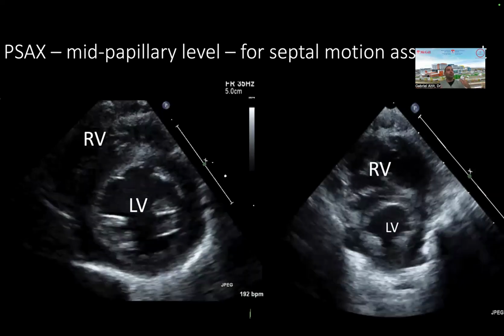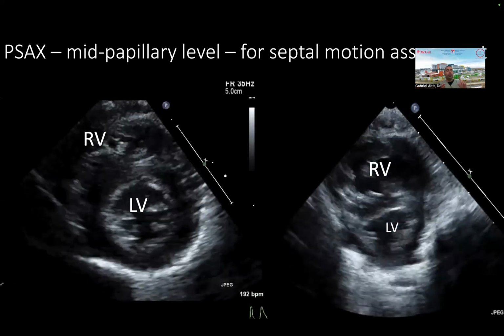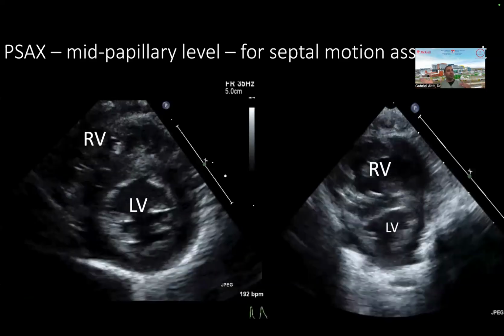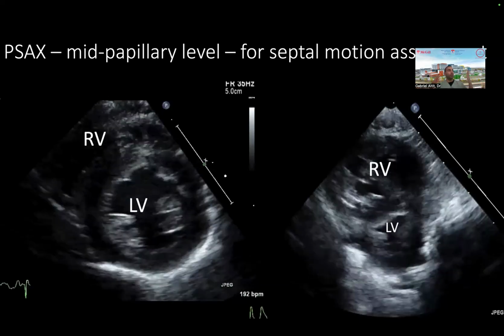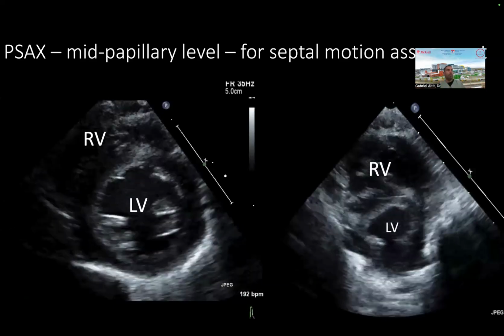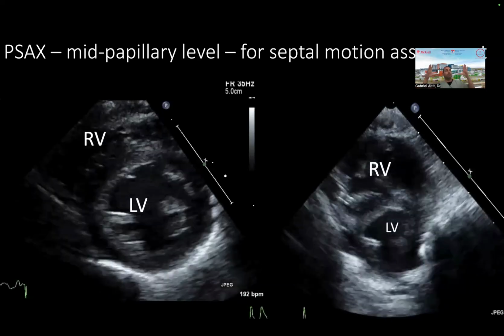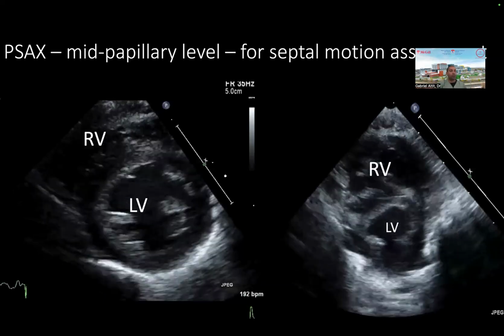So that's where, whenever you're looking at post-tricuspid shunts, so VSDs, PDAs, at septal flattening, it's always a relationship between the systemic circuit and what's happening in your pulmonary circuit, or what's happening after, at the level of the outflow tract. So of course, a patient who comes in with severe pulmonary valve stenosis will have a big dilated RV and will have a bowing septum because the RV is extremely pressure loaded, compared to if you have aortic stenosis, you may have a very big, actually dilated LV that will look like it's squishing the RV because there's such a big pressure load on the left ventricle.